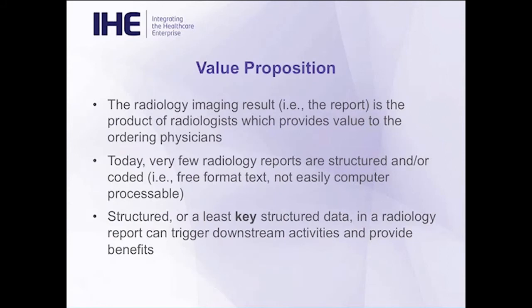So the value proposition, or why are we doing this profile? The imaging result of the radiology report is the product, or it's what the radiologist produces that provides value to the ordering physician. And so obviously this is something of a lot of importance to the radiologists. Today, most radiology reports are free format text. As free format text, they are not easily computer processable, or a computer cannot act upon the free format text. They can, but it's not simple to do.